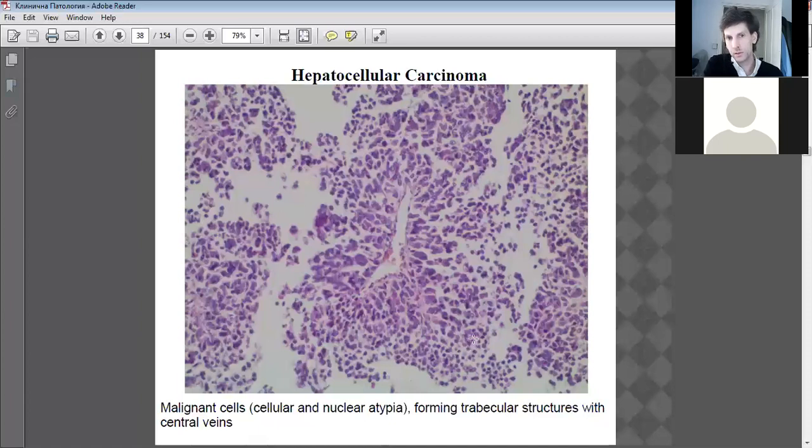So you've got loss of wall. To summarize, you've got loss of the wall of your vein. You've got a collapsed trabecula with probably a destructed vein over here, probably, because I could see some red blood cells. You've got overall abnormal cell division and big spaces forming.